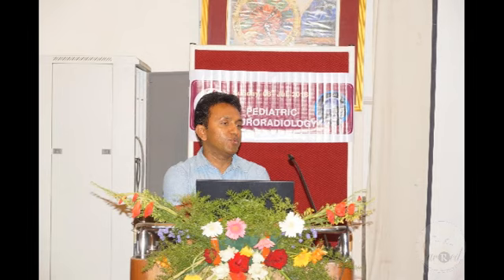So any questions about temporal bones? As I said, 70% are practicing radiologists. I'm sure all of you have read some temporal bones and had some questions at some point of time. No? Okay. You made all the findings. That's great.